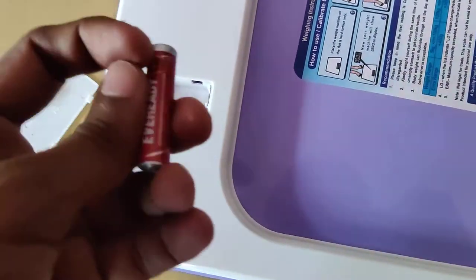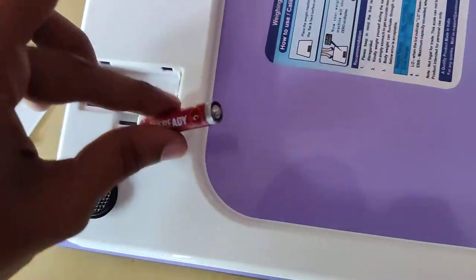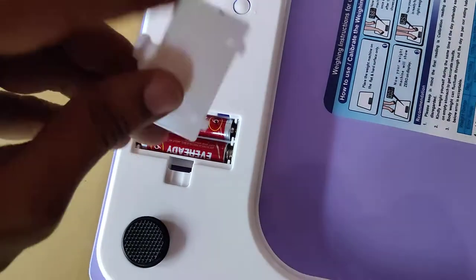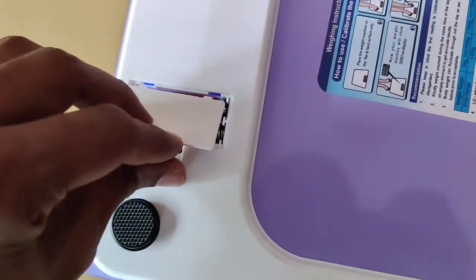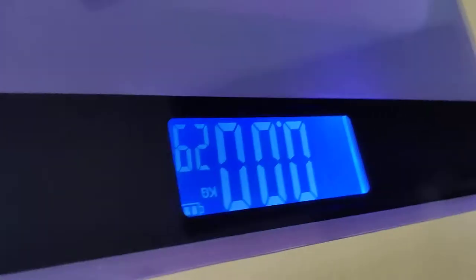For the second battery, I am going to insert it in the opposite direction — the negative side touching the spring. Now both batteries are properly inserted. Close the back cover. You can see that the scale has turned on.